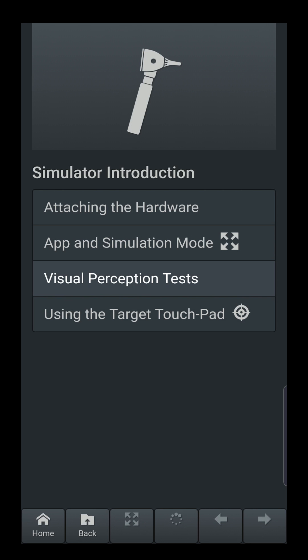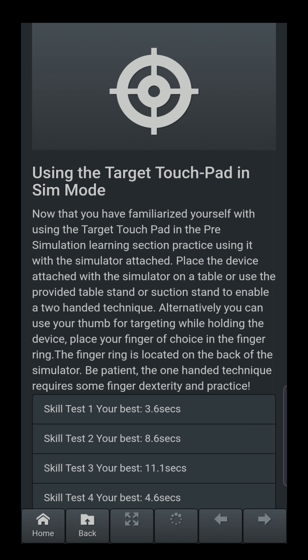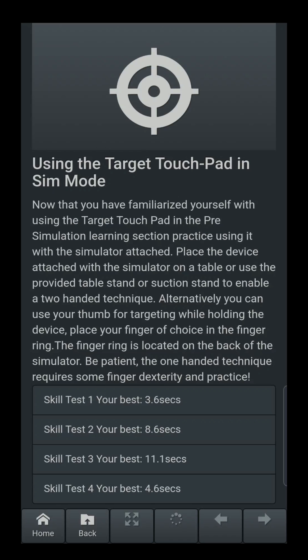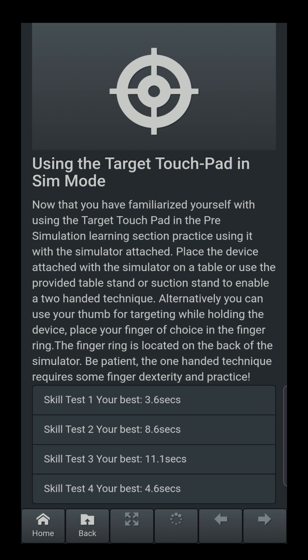From the visual perception test, you must now be able to use the target touchpad with your simulator attached to your phone. There are the same skill tests as in the pre-sim teaching, but now you use them with your simulator attached. Using your otoscope, you look down at the image and use the capacitance touch screen targeting mechanism to move to the target and tap, taking you to the next target.